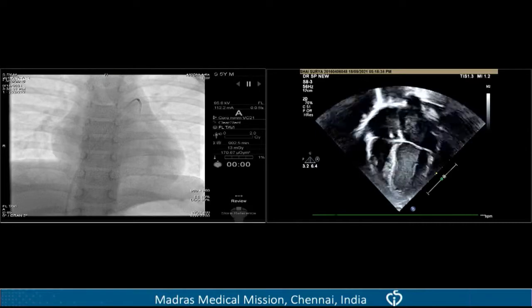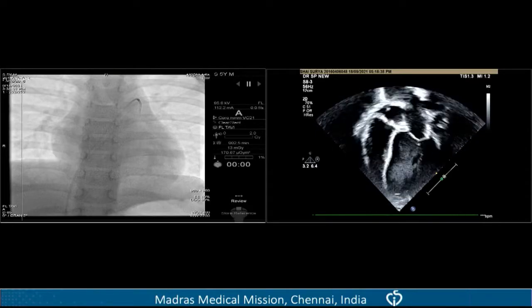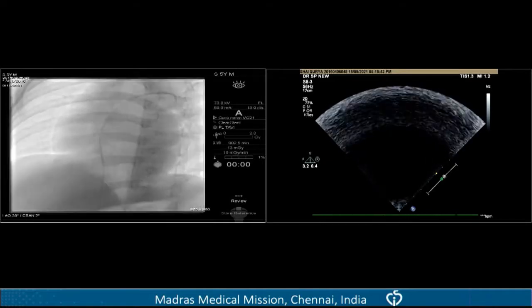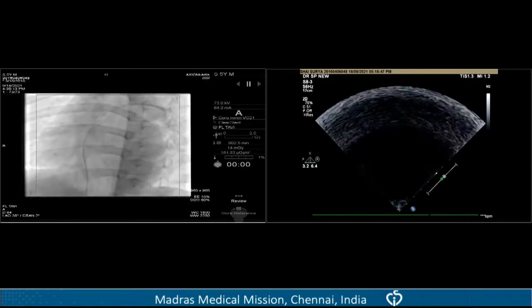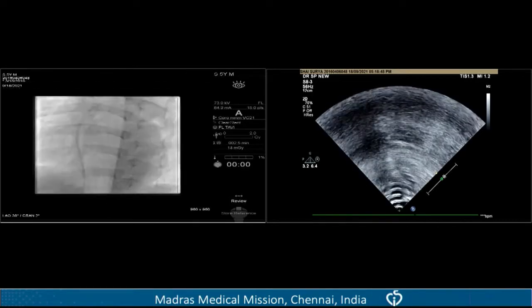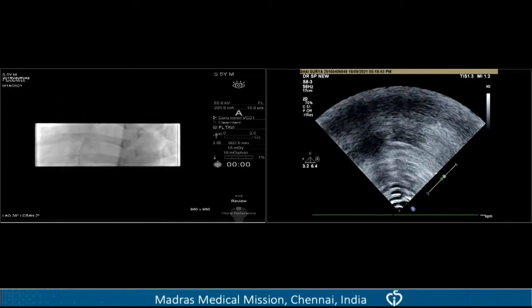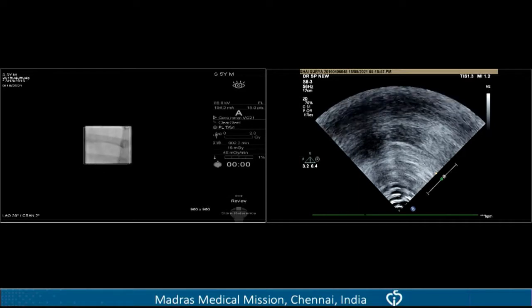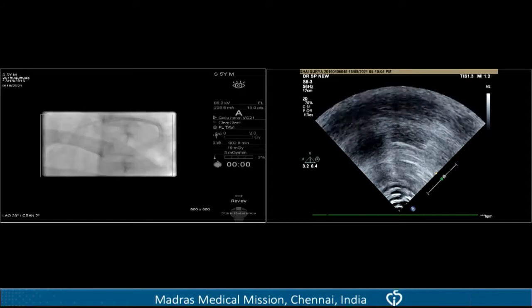Okay, flush everything. Can you collimate now? Pramod, take your hands out. I will first collimate. This is a venous sheath. Now collimate sharp. Don't allow the apex to be seen. I want an apical echo. Further and further collimate. Close it. Okay, not so much. Now you can't see anything. Now zoom it. Okay, now a little bit open it.